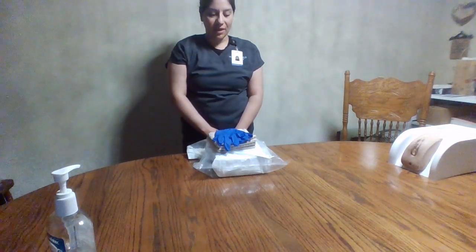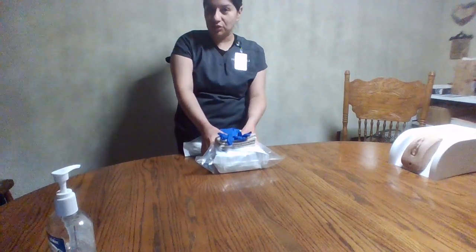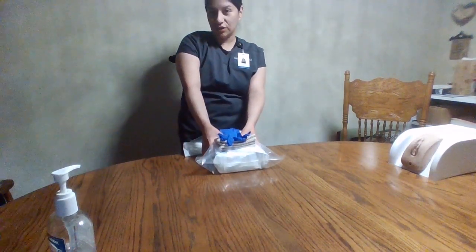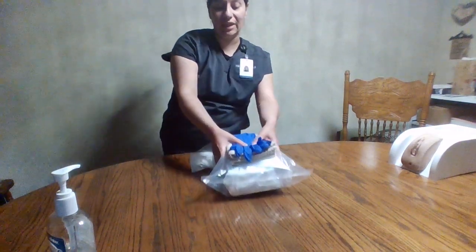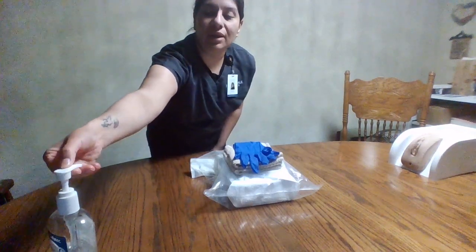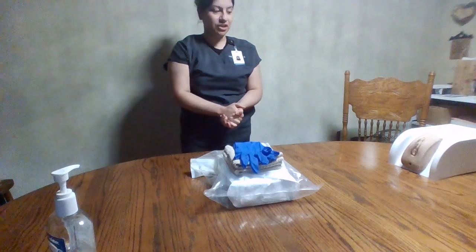So I will begin by gathering the necessary items and entering the patient's room, making sure to close the door as well as the curtain to ensure patient privacy. And I will make sure to place my items on a clean, flat, dry surface. I will go ahead and begin hand hygiene and introduce myself to the patient.